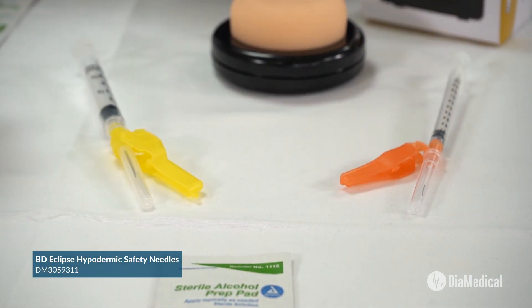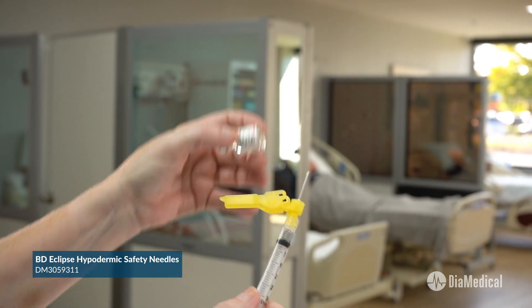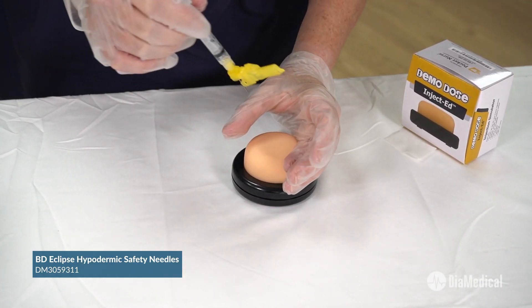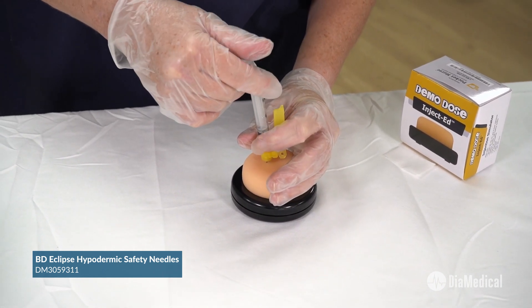Inject-Ed is also ideal for teaching students to administer IM vaccines into the deltoid muscle. The trainer can accommodate Z-Track injections and needles up to one inch in length.